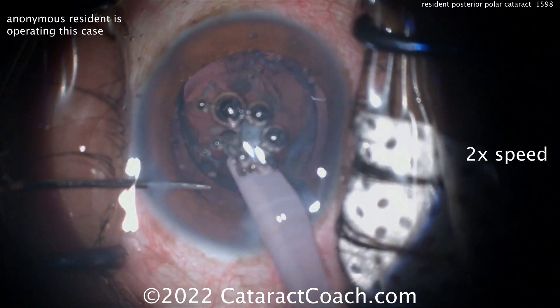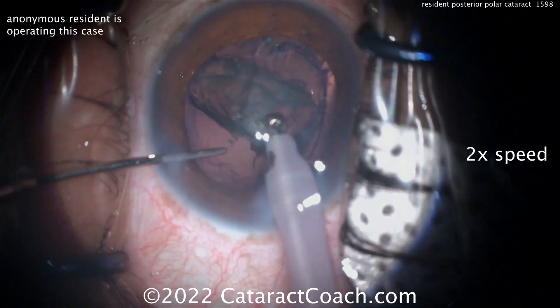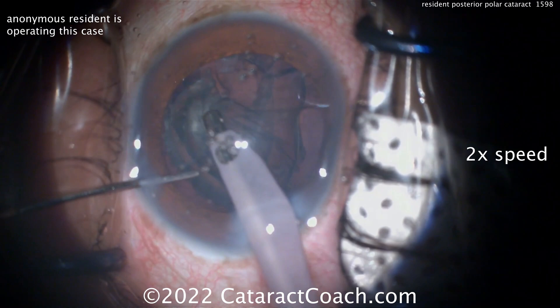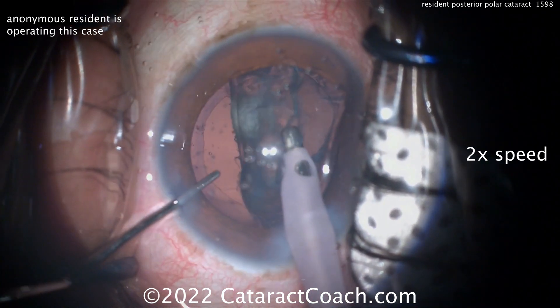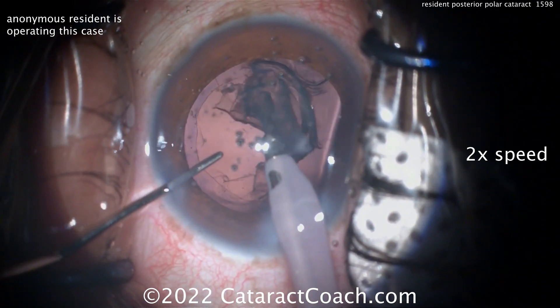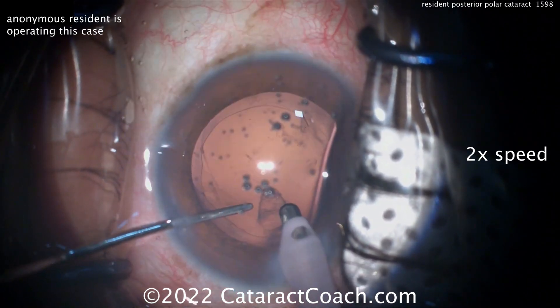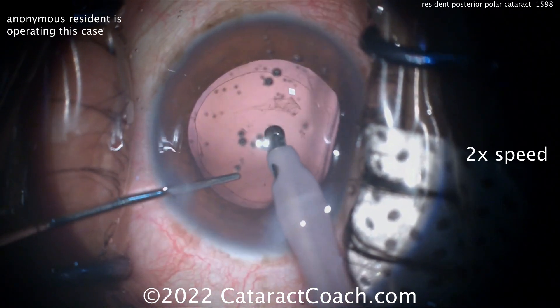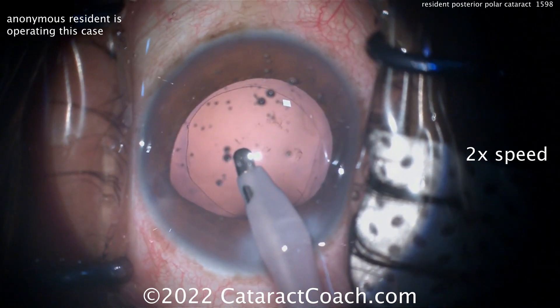Now switching over to the IA probe — nice and controlled here, just trying to get everything up nice and easy. Because the nucleus is gone, there's obviously no risk of dropping the nucleus; it's already been removed from the eye. So even if there is a break here, notice how the whole sheet of the epinuclear shell is coming out together at once — that looks great. Nicely cleaned up. Importantly, if there's some stuff stuck right here to the posterior capsule, do not touch it. Leave it alone.